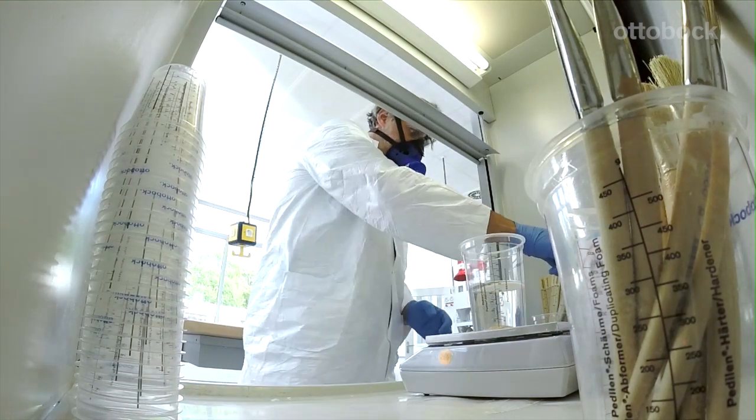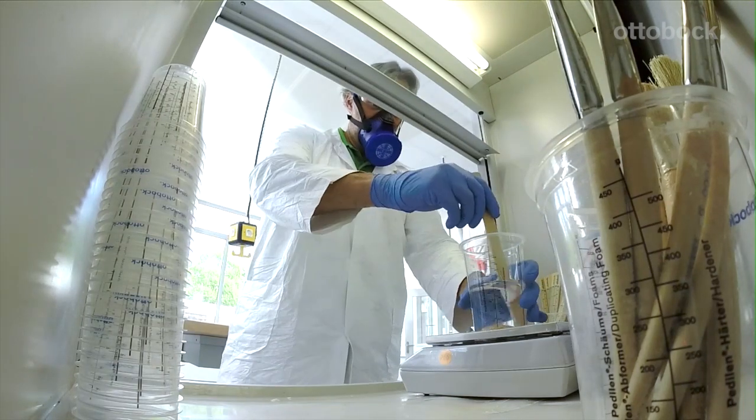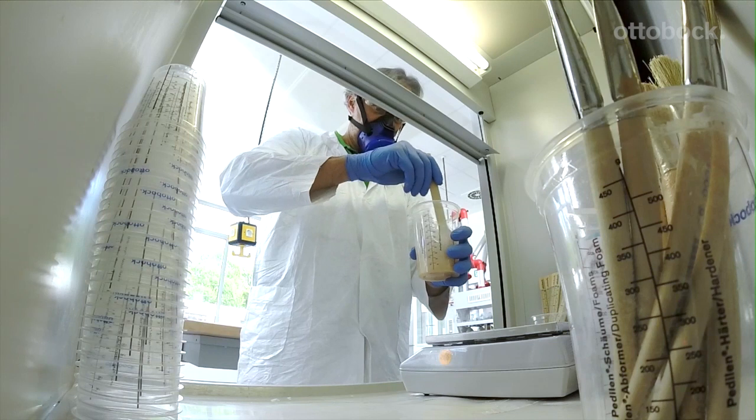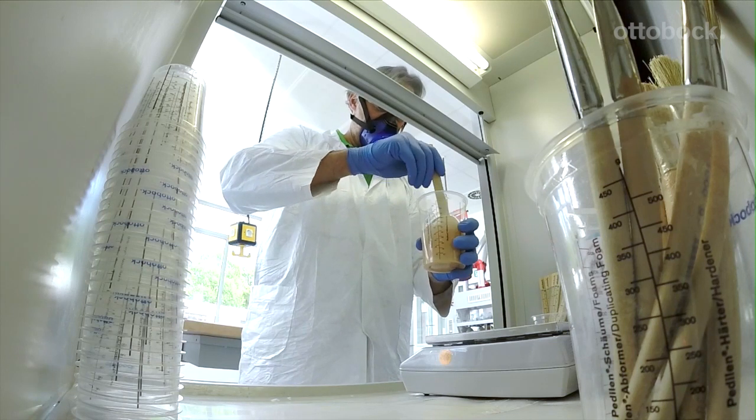I mix the chosen color paste into the resin. This too is easier since the paste mixes far more readily compared to more viscous resins. Naturally, the same applies to the hardener powder.